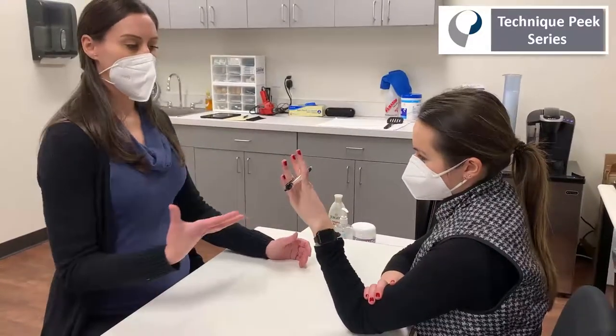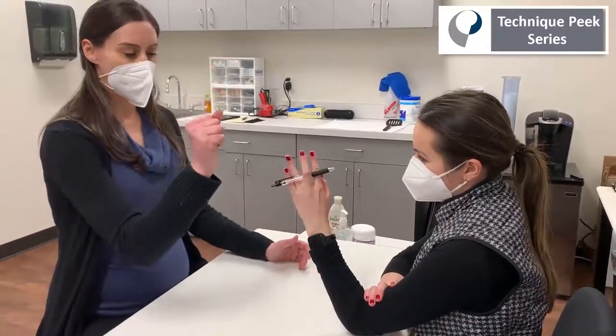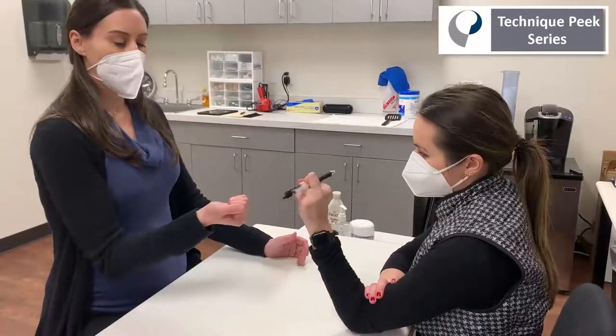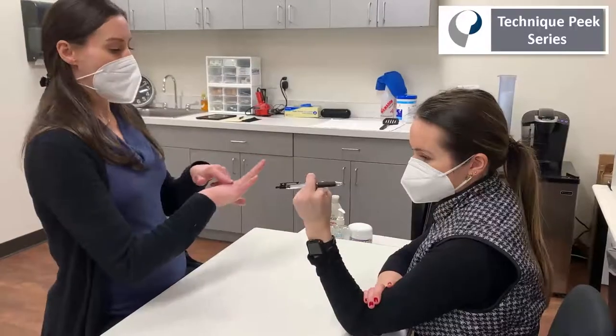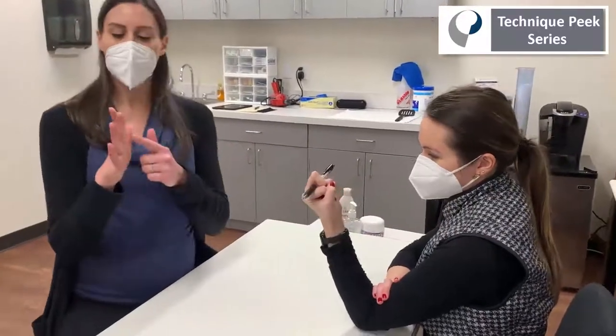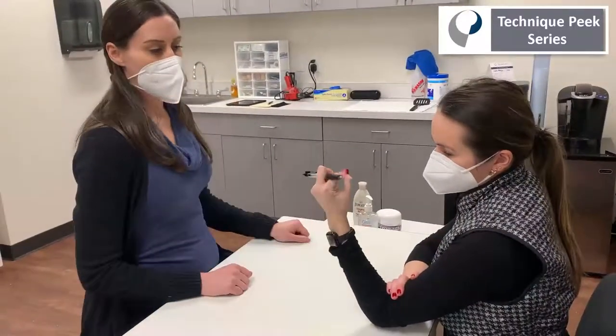So that way, as they're wearing the splint and they're flexing that finger, those powerful extrinsic flexor muscles are then bypassing the MP joint and that force is really redirected to that PIP joint.